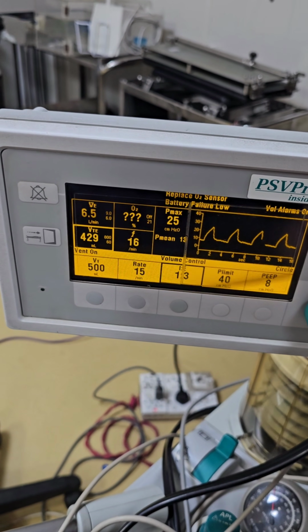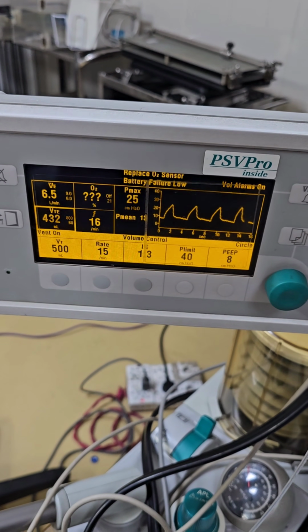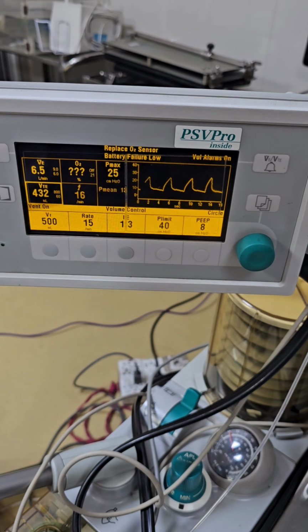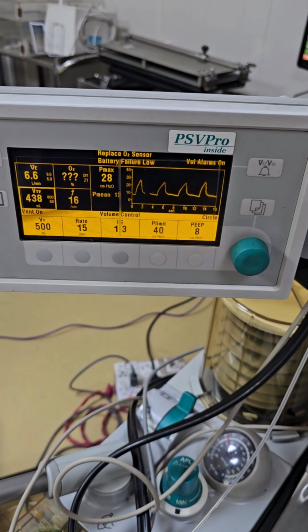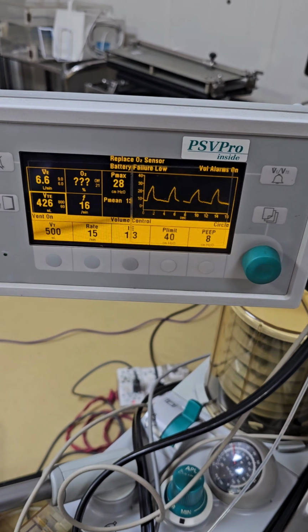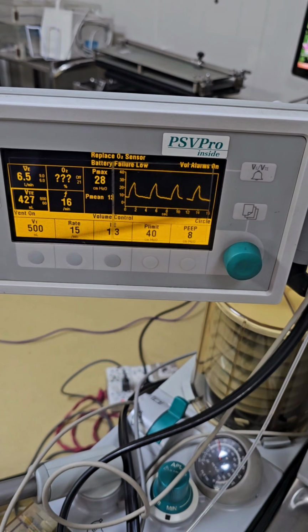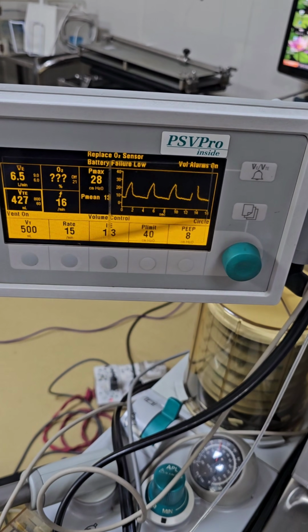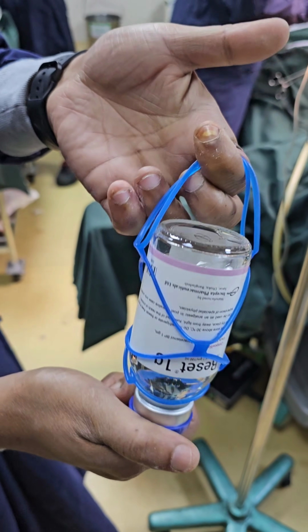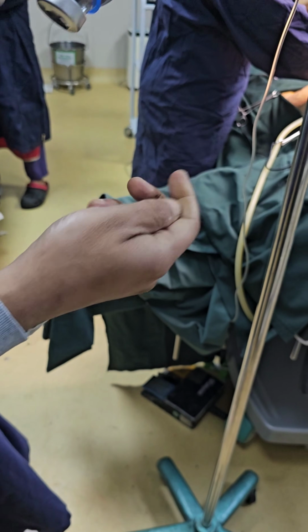We increase the expiratory phase of the ventilator, so you can see the increase of expiratory tidal volume. You can see the incremental increase of expiratory tidal volume, 426 ml, 427 ml, slightly increased from the previous. And now we are giving paracetamol, acetaminophen, which is branded as Reset, 1 gram.